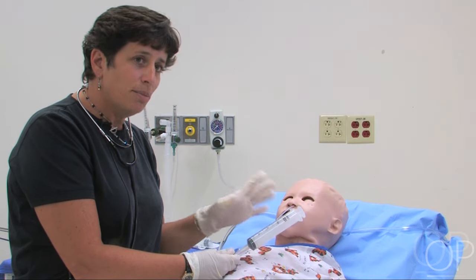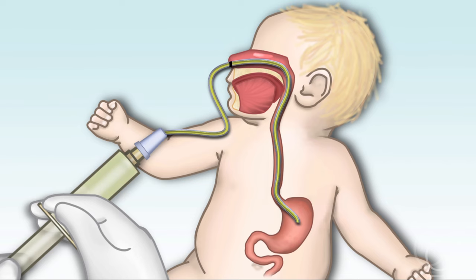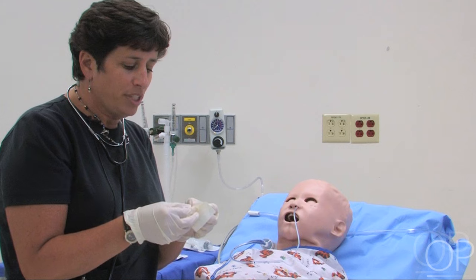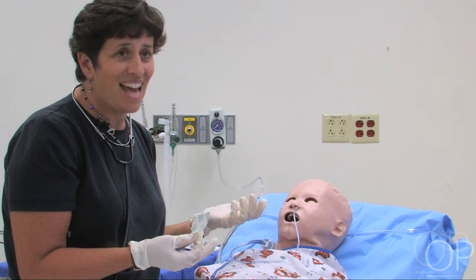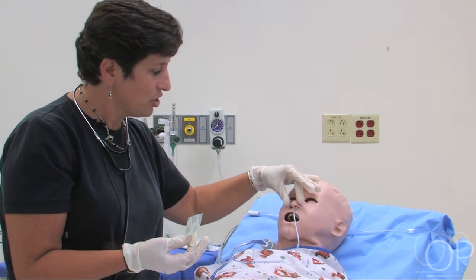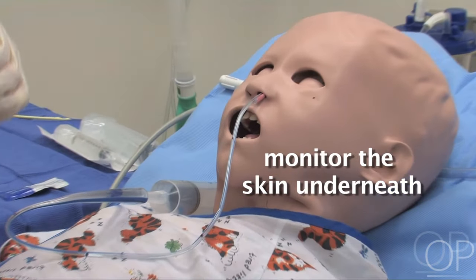Once the tube is thought to be in, you can try to get an aspirate for pH testing. Then you need to secure your tube and get it hooked up to suction. I'm going to use a transparent dressing for him. You want to make sure you tape the tube so a small child can't get at it, and also so that it doesn't sit against the side of the nose, which could potentially cause trauma and breakdown. I prefer to tape it to the side with a small transparent dressing so that you can monitor the skin underneath as well.